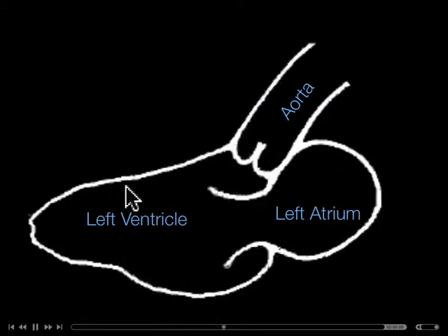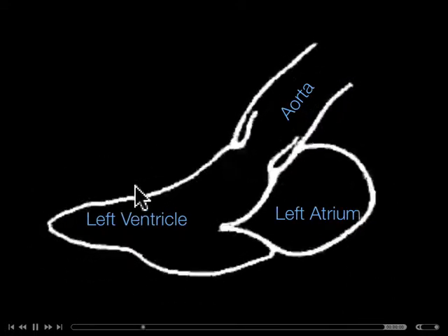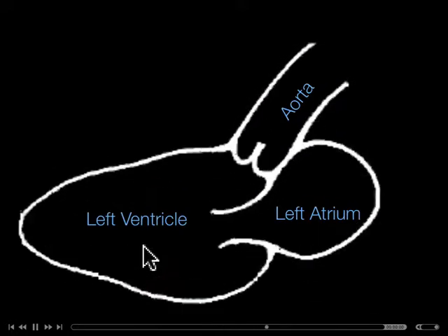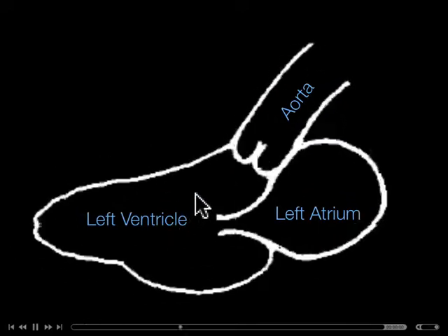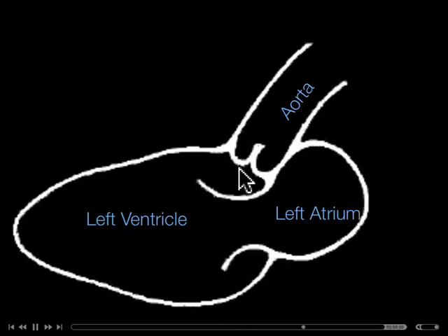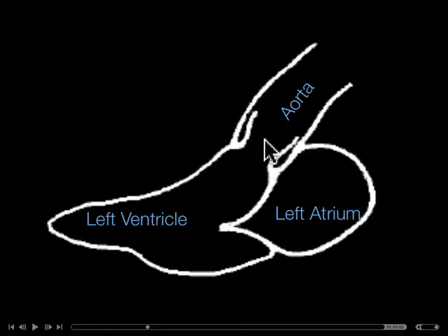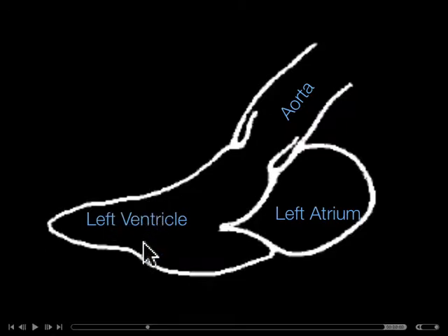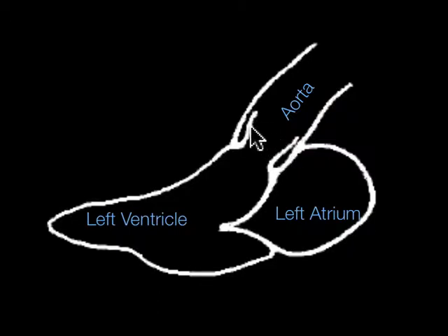And that's one of the normal findings we see. The other thing we look for in normal contractility is this interventricular septum right here. We like to see that come towards that posterior wall, and vice versa. We like to see these two things squeeze together, and that's another sign that there's good contractility. And then finally, this is the left ventricular outflow tract here. I'm going to go ahead and pause it right there. And this is end systole. We can see that the heart is all nice and contracted down with the septum towards the posterior wall. At end systole, these valve leaflets fly open, and this distance right here is called LVOT, or left ventricular outflow tract, and that becomes a critical measurement when we want to measure the cardiac output.